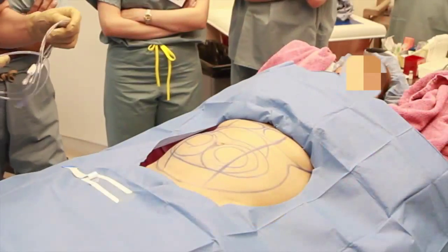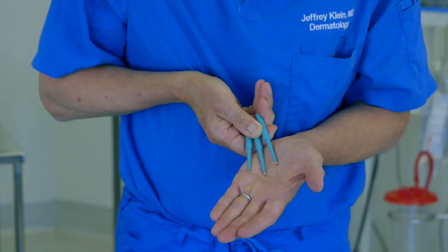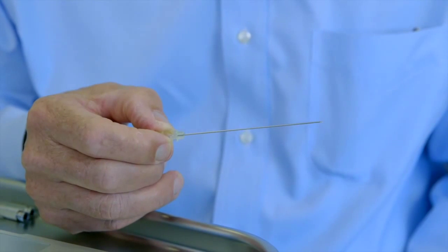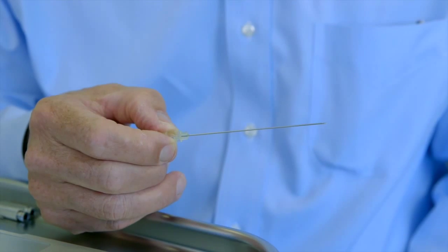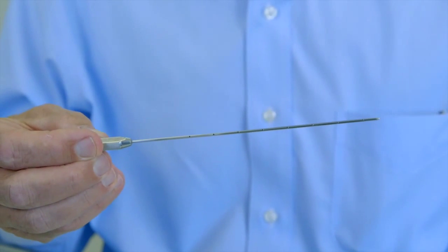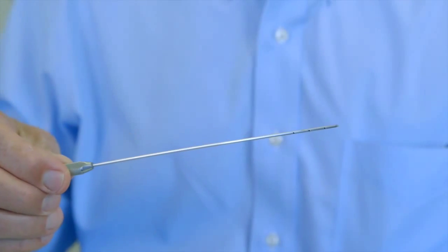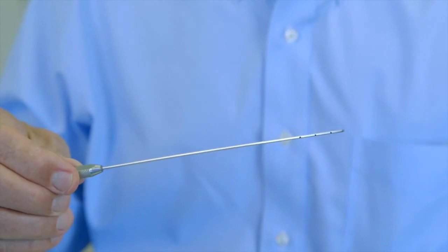The technique involves four phases. First is making adits in the skin, which are small holes made with the punch biopsy for introducing infiltration cannulas. Second is using a spinal needle to infiltrate small amounts of fluid that will allow subsequent infiltration with a larger blunt-tipped cannula. The third is using a full Monty cannula for a large volume of tumescent infiltration. And finally, the fourth involves using a tip Monty to check all of the areas of infiltration for complete anesthesia.